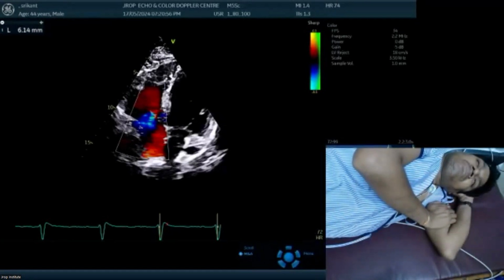Suppose the principle of this comes from mitral stenosis patients. Those who have mitral stenosis with pulmonary artery hypertension, what will happen? The RV and RA become bigger in size. When the RV and RA become bigger in size, what will happen to this annulus? It becomes bigger in size. So you have a tricuspid regurgitation where vena contracta would be large. To correct it, we put a tricuspid annuloplasty ring to reduce the size of this vena contracta. We'll come to those points later on one by one. Thank you, sir.